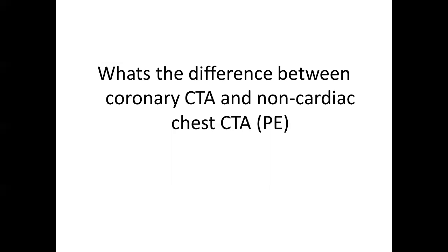The breath hold. So for a chest PE, there's still a breath hold, I think. But I know for the lungs and stuff, I think they do still ask them to hold their breath, Ryan, unless you know for sure, because I'm not sure now.